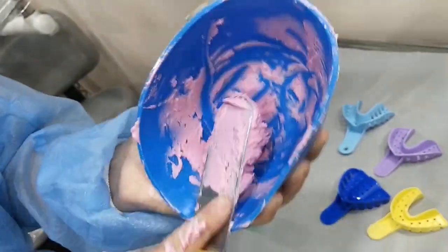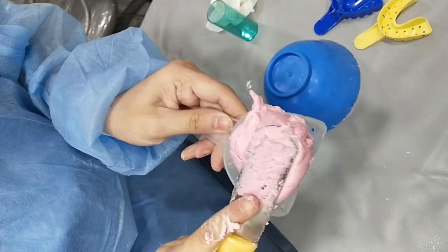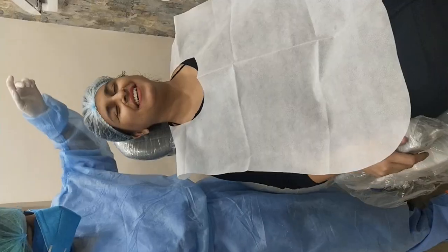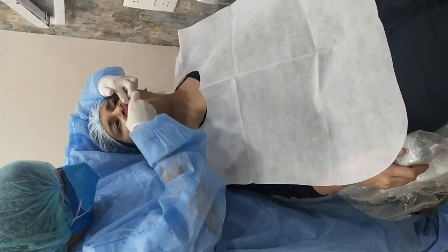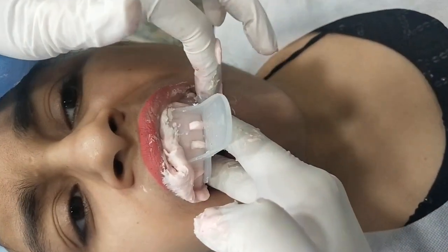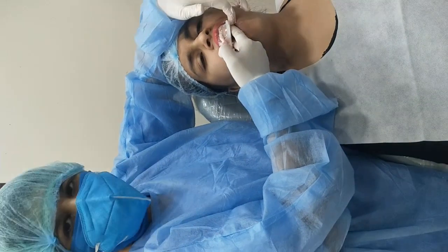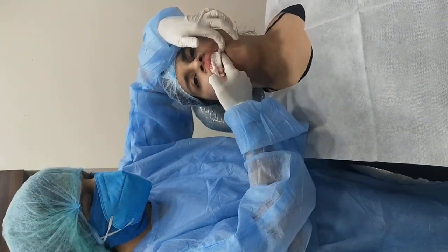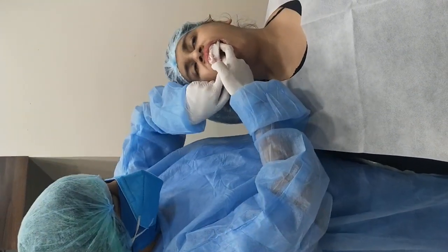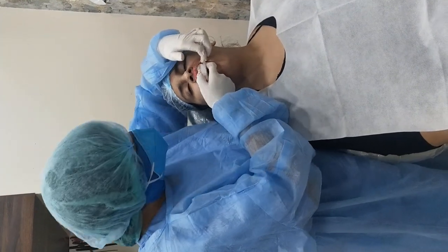Keep mixing and pressing the material against the walls until you get a smooth mix, and once you get a smooth mix it is time to load the tray, again avoiding any air bubbles, and place it in the patient's mouth. Generally what people do during impression making is they remove their hand and let the impression set in the patient's mouth only, but we should avoid that mistake. Keep both fingers inside the patient's mouth and let it set for approximately 30 seconds, then we'll have a very nice impression.